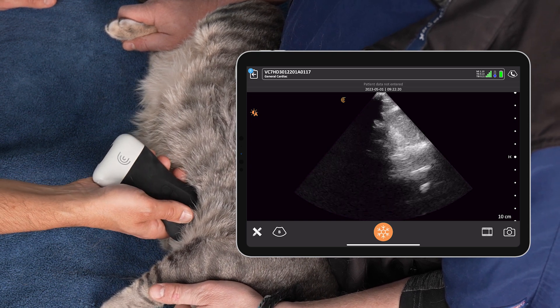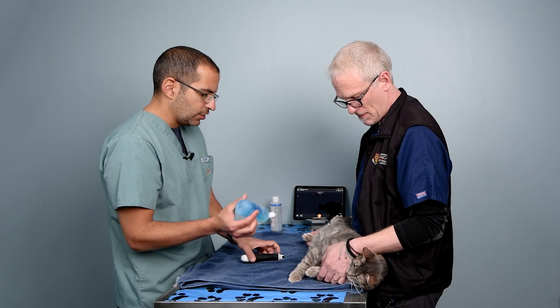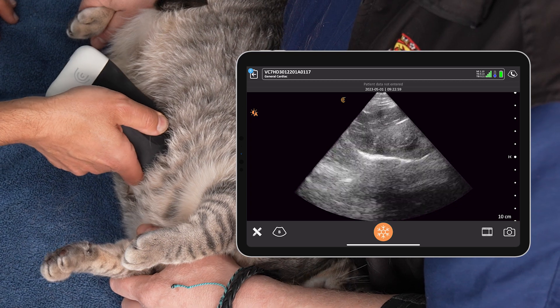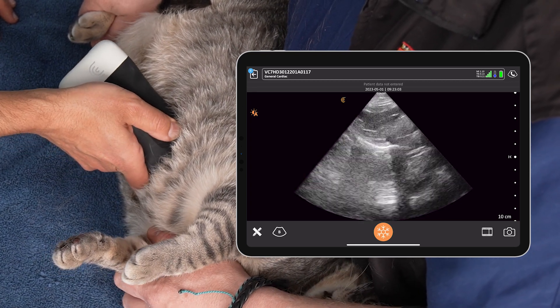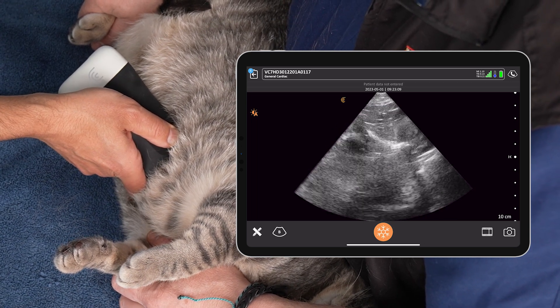Interesting enough in Daisy we can actually see the heart touching the diaphragm — there it is beating over there. In a lot of cats the heart does not touch the diaphragm. There's the heart coming in, right there — you see the heart beating. We don't see the entire heart but we see enough to ask the question: do we have obvious pericardial effusion, yes or no?